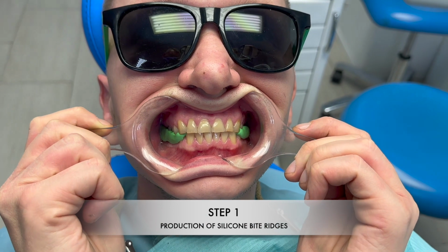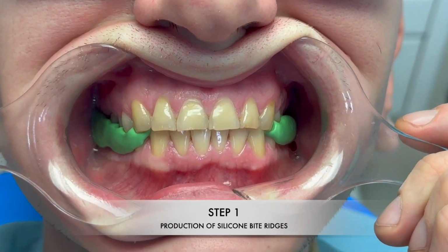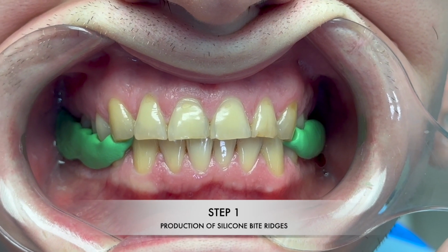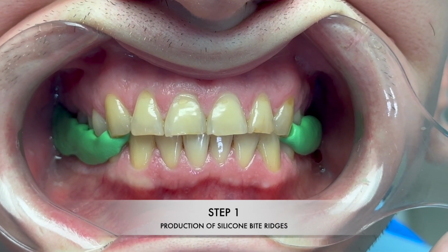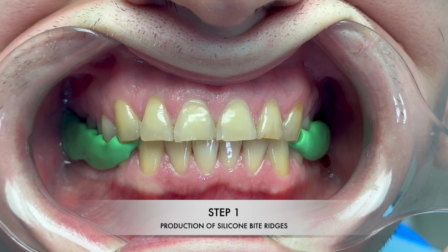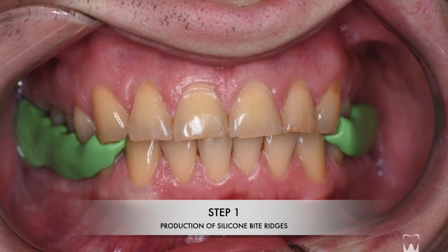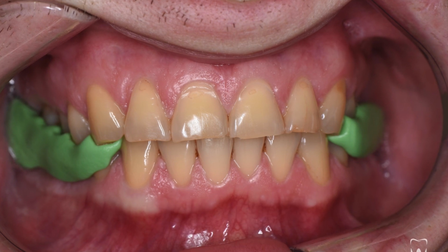Step 1. Make occlusal bite ridges on both sides. Why not a bite ridge on one side only? Because the patient in 90% of cases will shift the lower jaw towards the bite ridge and we will get incorrect contacts of the restored tooth with the antagonist.